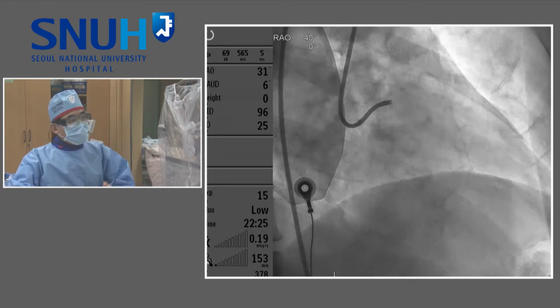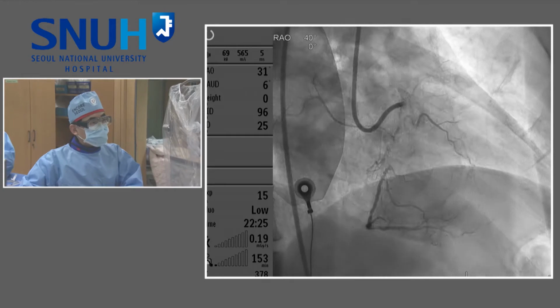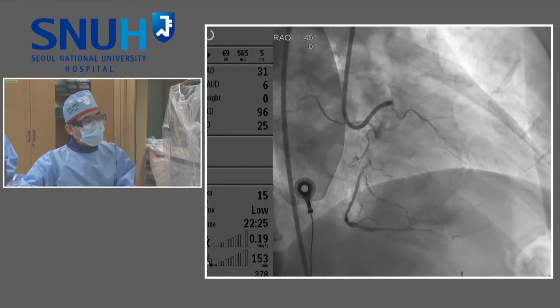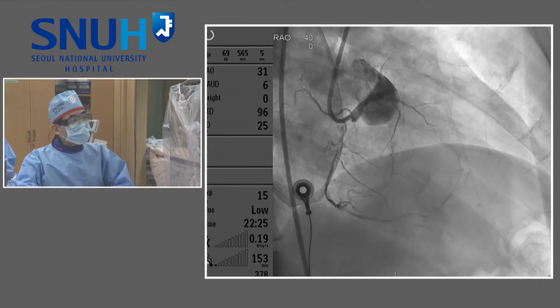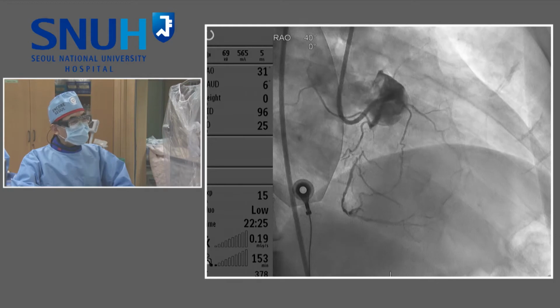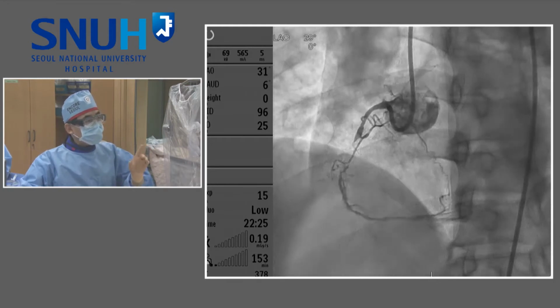The point that I discussed with Dr. Asakura is the morphology of the distal true stump. There is a kind of stepwise morphology. Which is the true distal stump, the upper one or the lower one? Once again, you can see the distal stump is a little bit tricky.